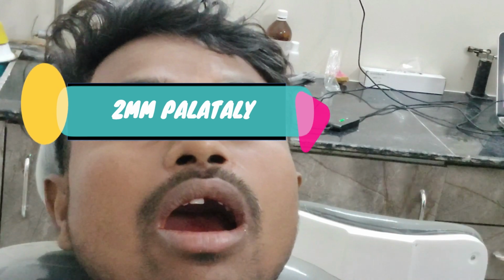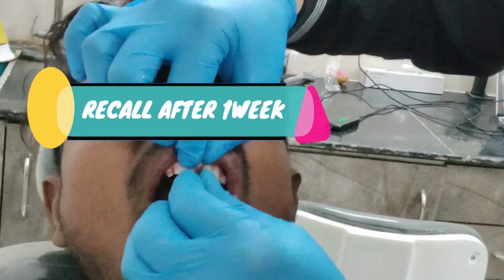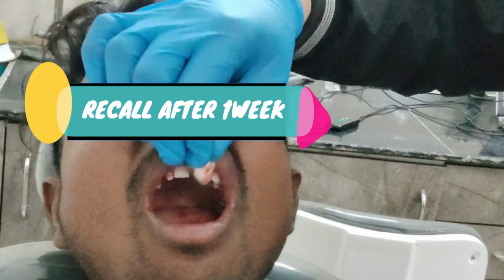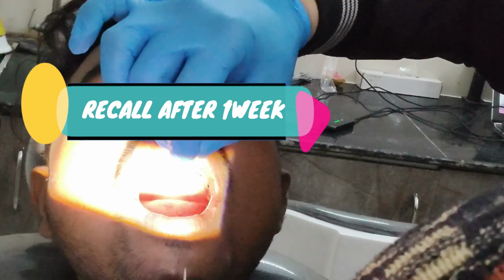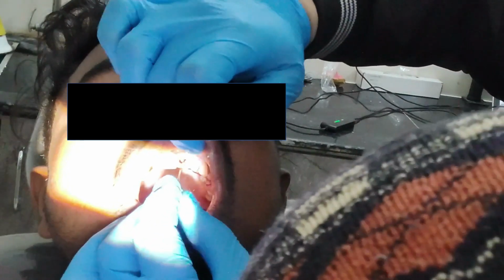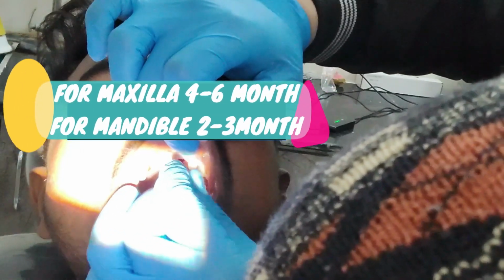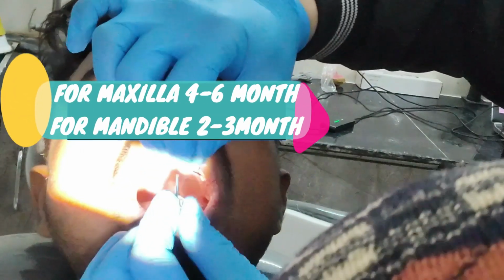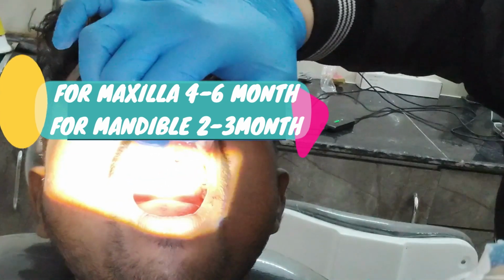After attachment of the healing abutment, post-operative instructions were given to the patient, and then we'll recall the patient after 1 week for follow-up. And always remember, the patient must wait for 4 months for the bone to grow and heal around the implant for prosthetic rehabilitation. In the maxilla, we have to wait for 4 to 6 months, and in the mandible, we have to wait for 2 to 3 months for the prosthetic rehabilitation.